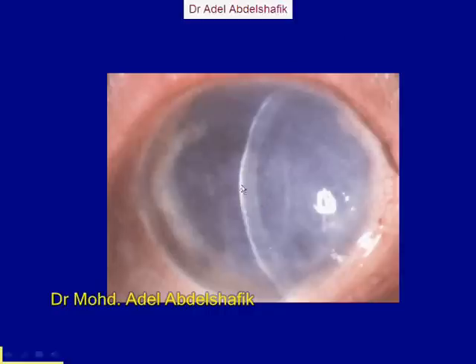The idea is whenever you get edema, the whole corneal thickness will move in a posterior direction. The anterior surface is almost stable, but the posterior surface, the thickness will increase in a posterior direction. Now, this back surface, if there was no edema, it will be stretched at one level. If there is edema, the back surface will be stretched in a second, more posterior location.